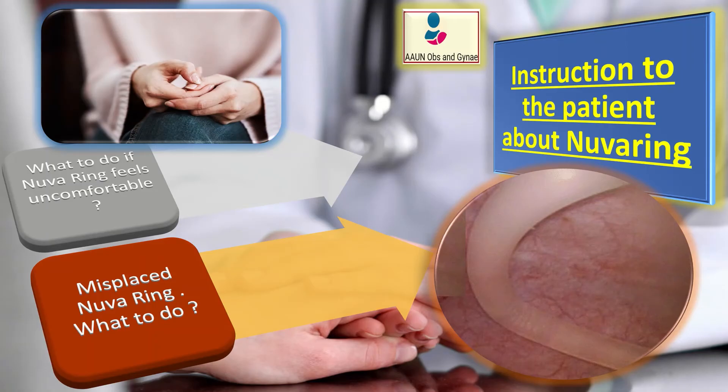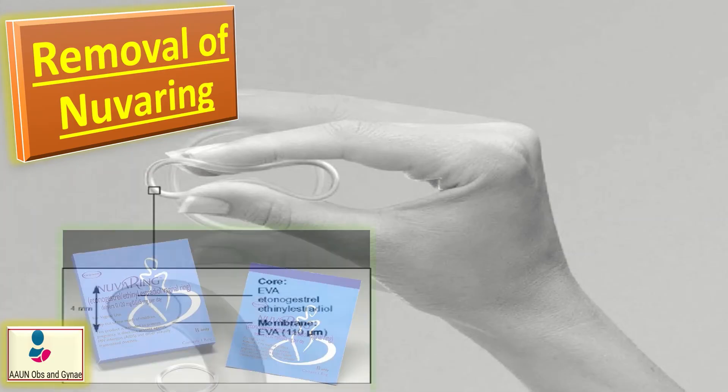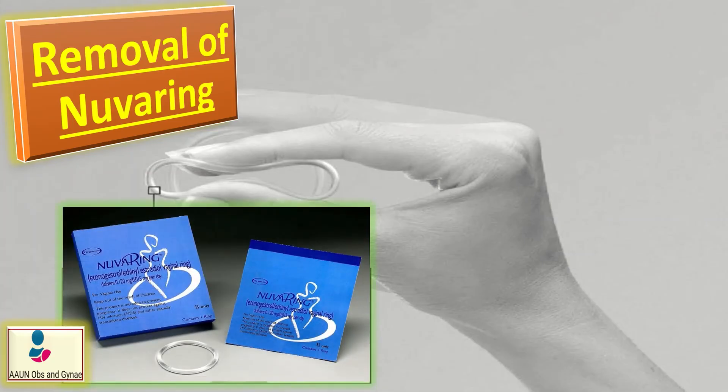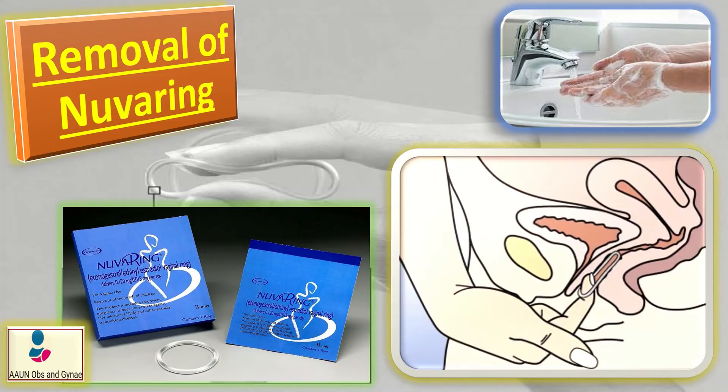For removal of NuvaRing, open the pouch — each ring comes in a resealable foil pouch. Wash and dry your hands before removing the ring from the pouch. Remove the NuvaRing gently with your index finger, then keep the foil pouch to place your used ring in it before disposal.